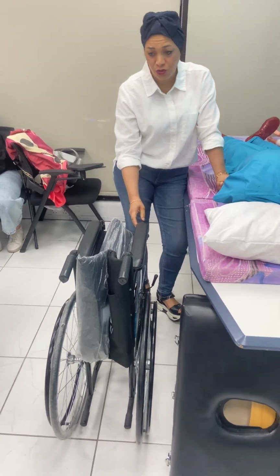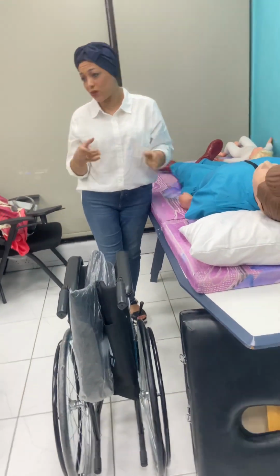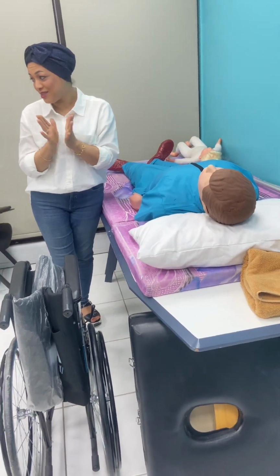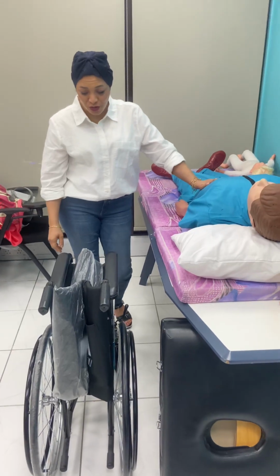Okay, so I introduce myself. I go wash my hands, wear my gloves. Okay, this is very compulsory. We don't forget about hygiene and PPE. Okay, and then we come back to the patient.